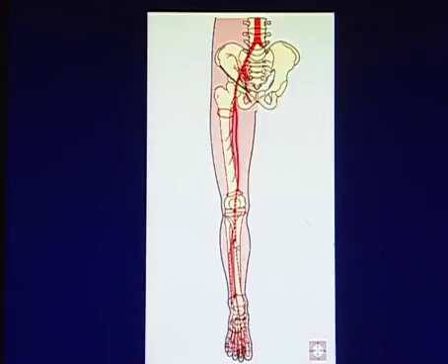And the peroneal artery, which also used to be called the fibular artery, is deep, next to the fibula, and actually can present some challenge to image properly in some patients.